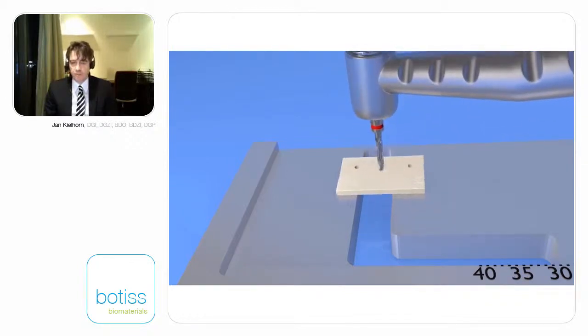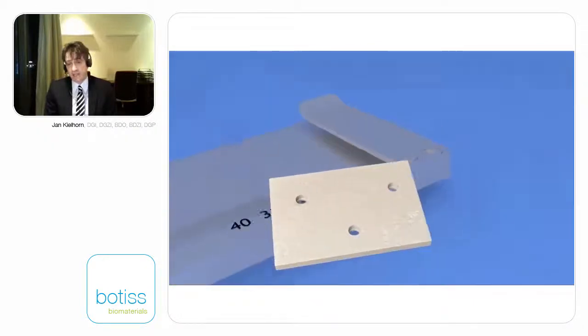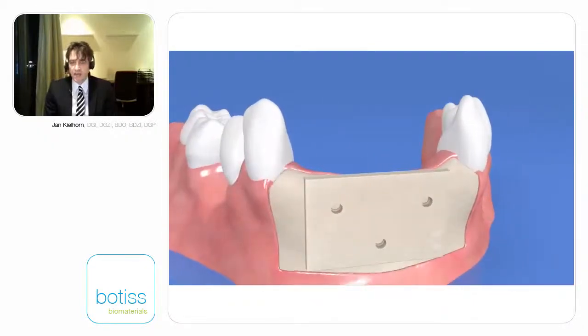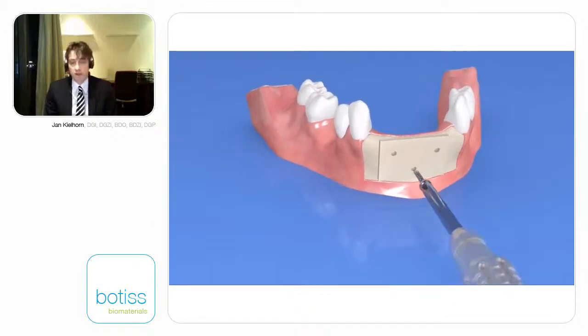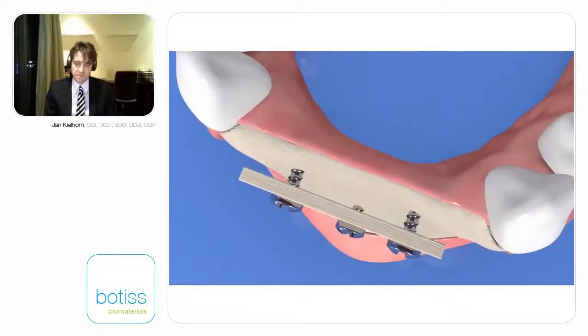So the following would be that you first raise, of course, the flap of your choice. If you use a Khoury technique, a normal flap design, or a lamellar technique or a tunnel technique. You can use either of these methods, very well known for bone block augmentation.